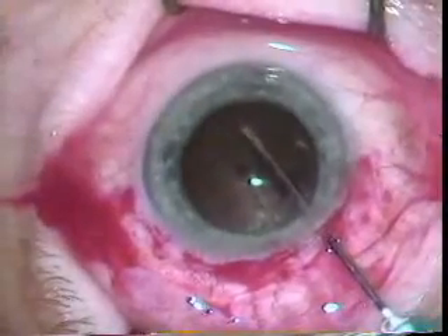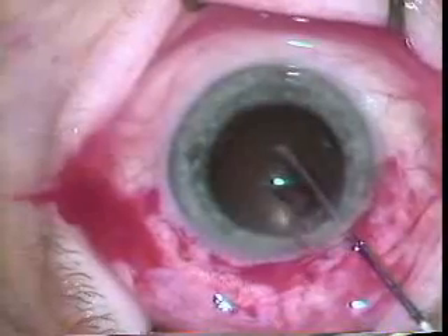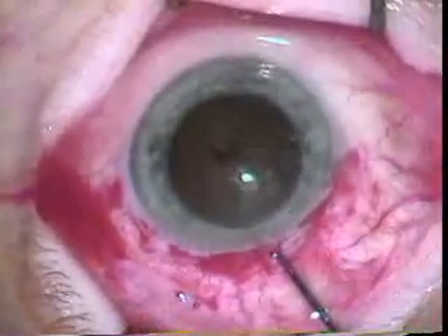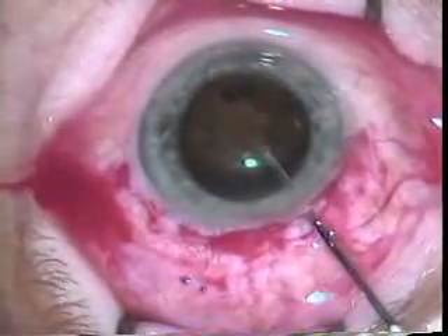Now with the cystotome he's rocking the lens free. No hydrodissection is done. With Dr. Colder's extra cap technique he's rocking the lens free, and the last motion is to put the lens up and rock it up such that it's ready to come out through the wound.